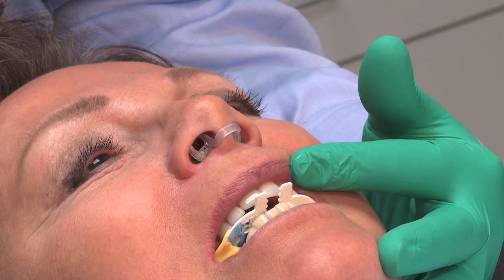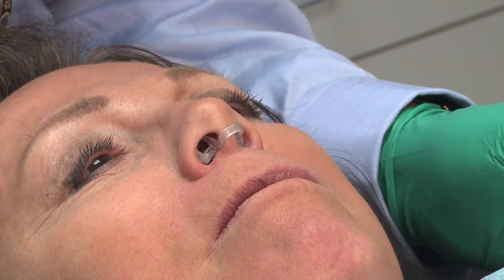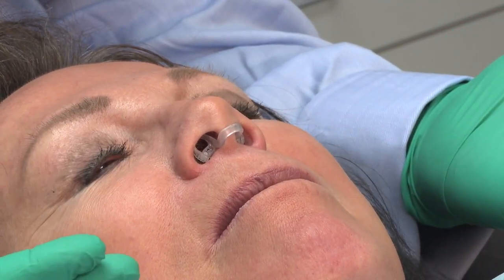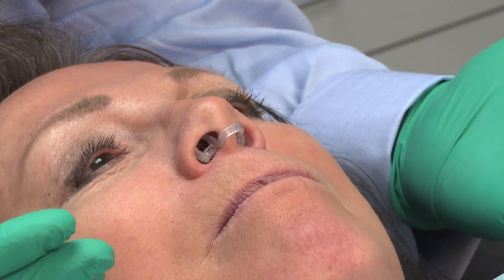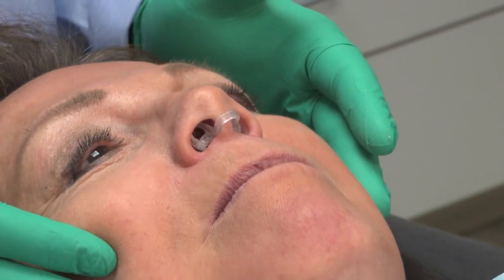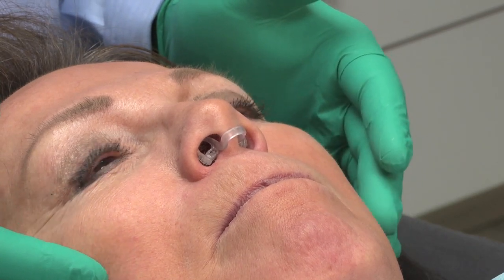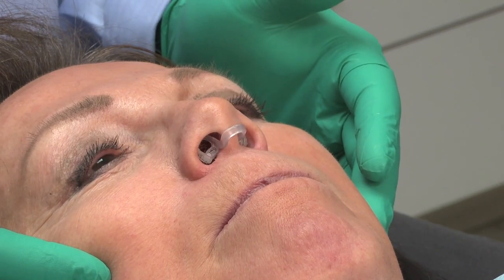The other beauty of this is we can now have her close, seal your lips together, and Kim, try and give us your best snore. You can see that the bite is set appropriately and that we have mitigated her snoring. So once again, it's great to verify that you have the right bite position, as well as verifying that they have no jaw joint discomfort. Kim, are you comfortable in that position? Yeah. Okay. If there's any question about that, you can always leave the bite in for 10 or 15 minutes, let the patient relax, and then come back and verify that they don't have any jaw joint discomfort.